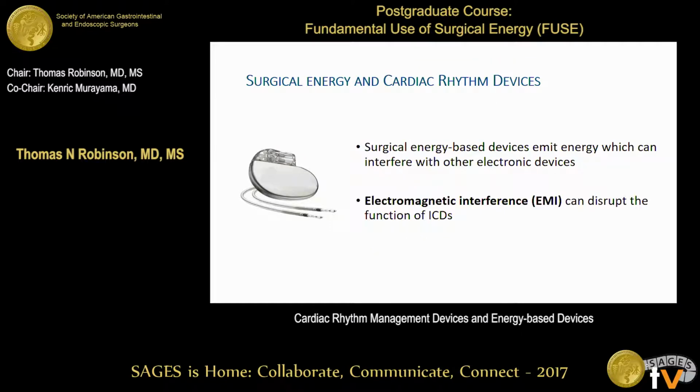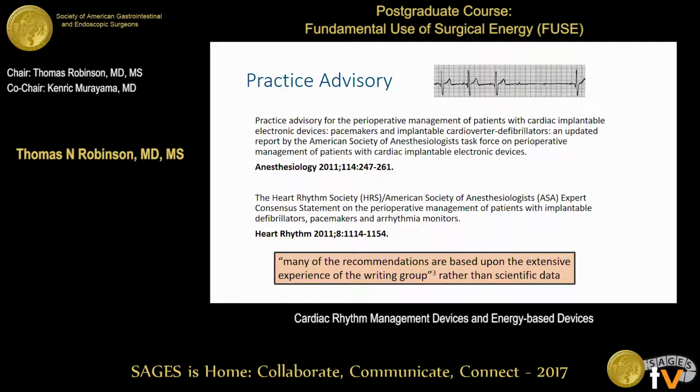With an aging population, this is a more and more common scenario where you have a patient who's got an electronic device. This is focused on cardiac devices, but there are also other electronic pumps, for pain, for all sorts of different reasons. So how do we want to use our high voltage energy device in the setting of these other electronic devices?